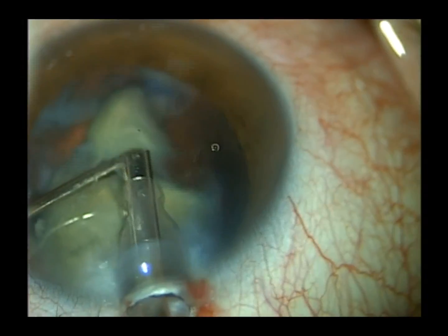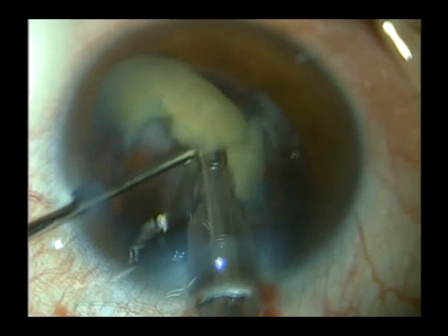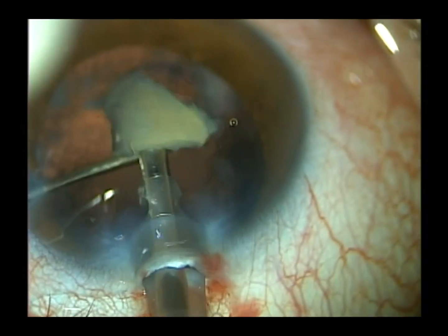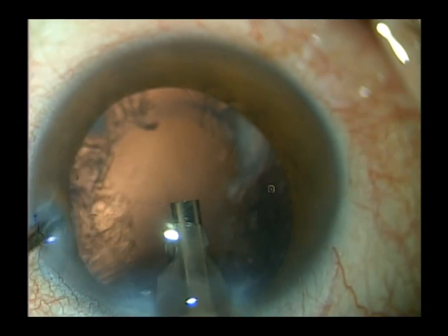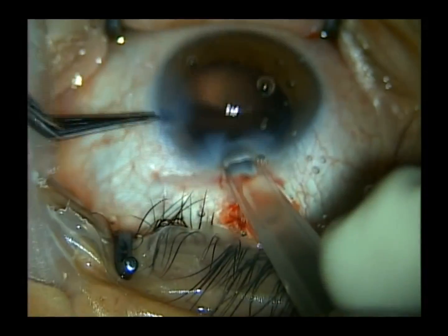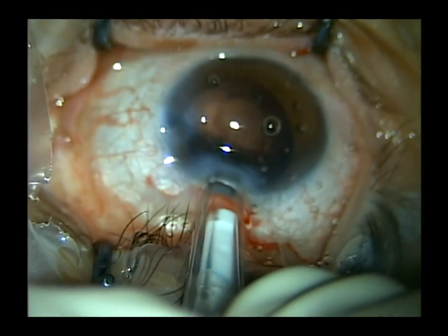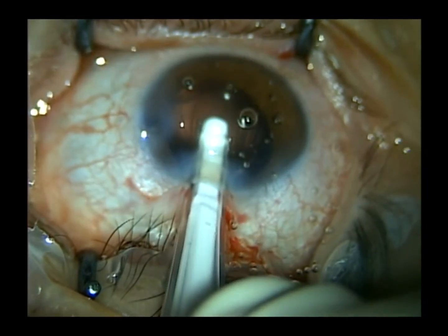As a precaution, I place my second instrument behind the nuclear fragments as I phaco them, just to prevent inadvertent capture of the posterior capsule if it were to come forward. We've completed removal of the nucleus. We used an LI-61 AO monofocal lens with aspheric optics and inserted it with a Softect injector into the capsular bag — a very nice delivery system. Pretty much in two movements we can insert the lens into the capsular bag.